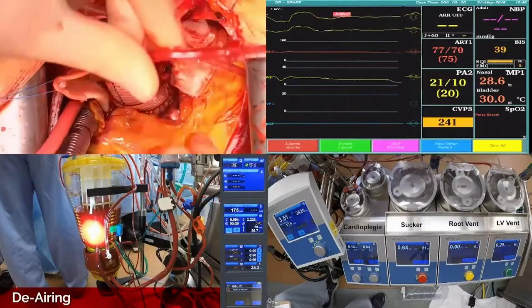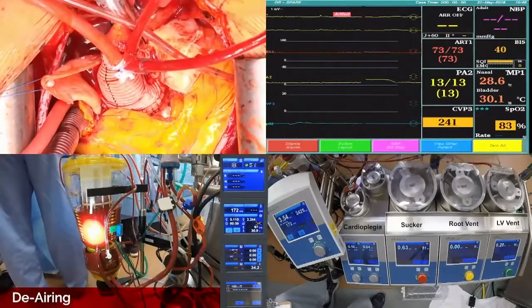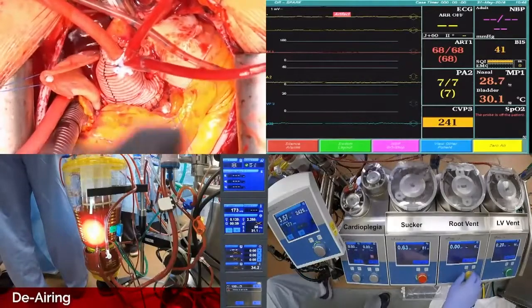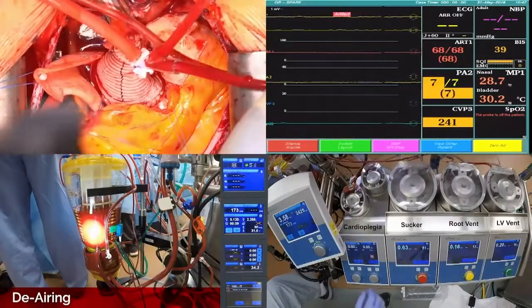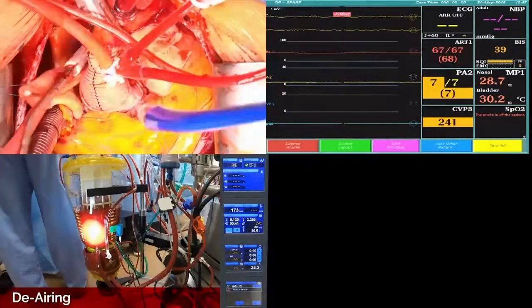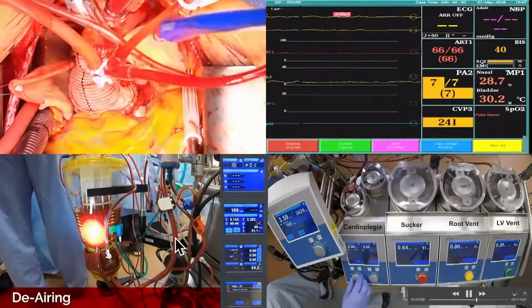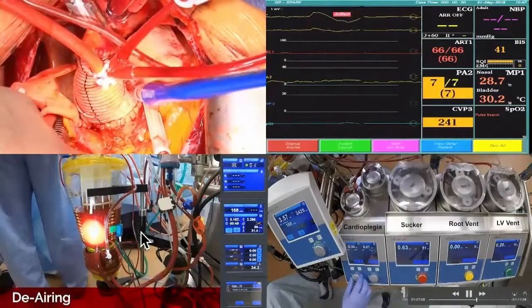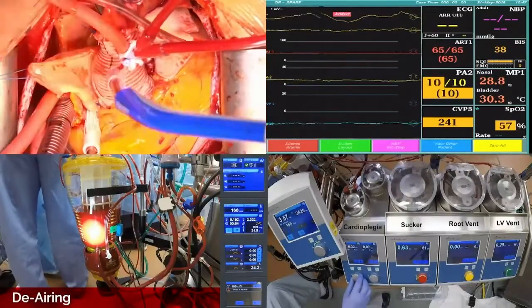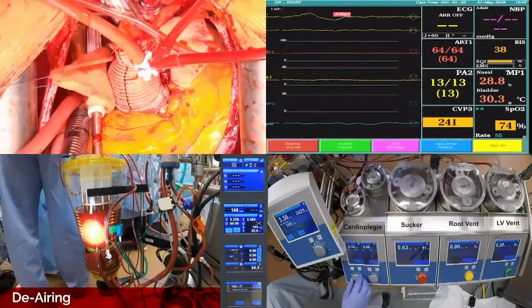So this is going to be the antegrade part of it, and the vent's already hooked up. And then I'm switching back and forth up there, communicating that, of course. My LV vents. You always tell us everything you're doing, there's no question about that. I'm going to agree with you on that, because during this time you are communicating, because there's a lot of switching going on. It's a little different. All right, so we're going antegrade now.